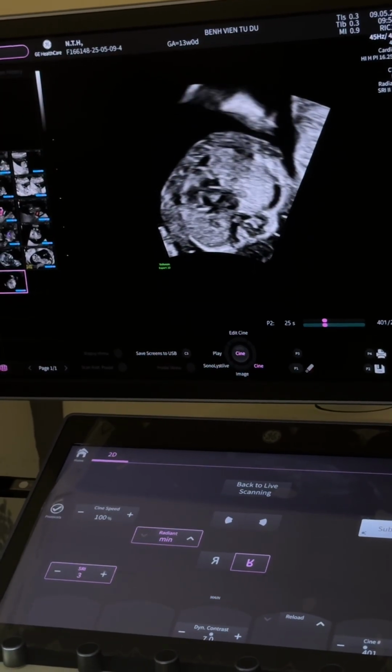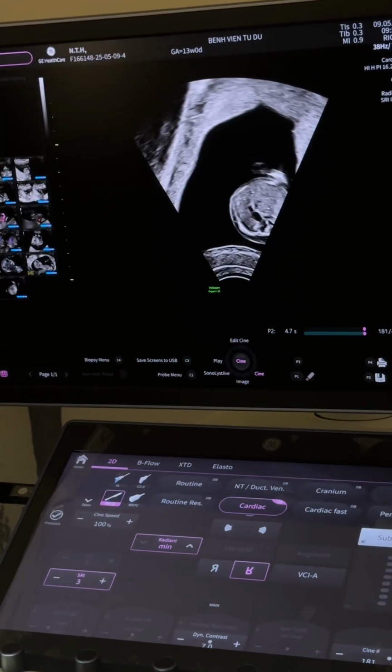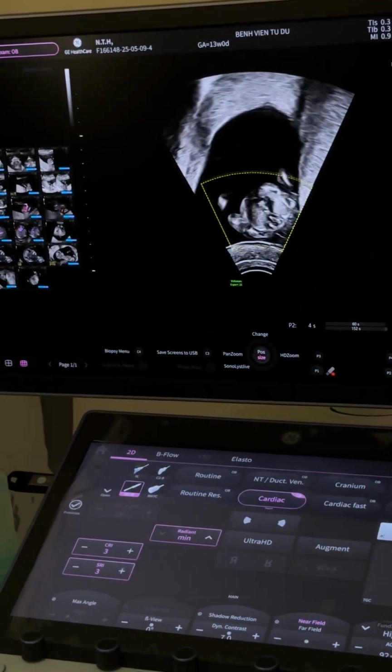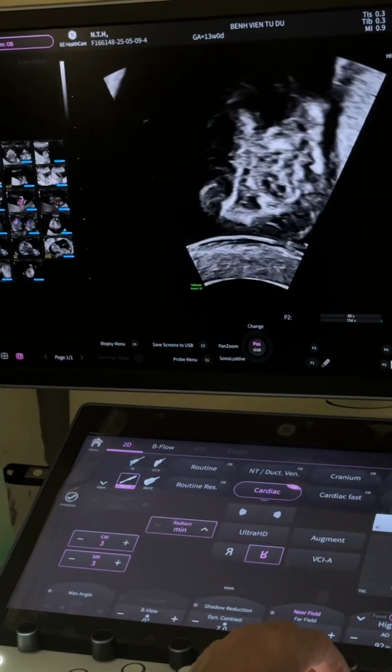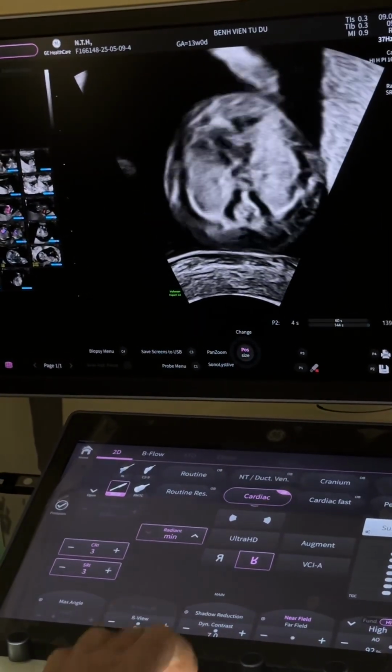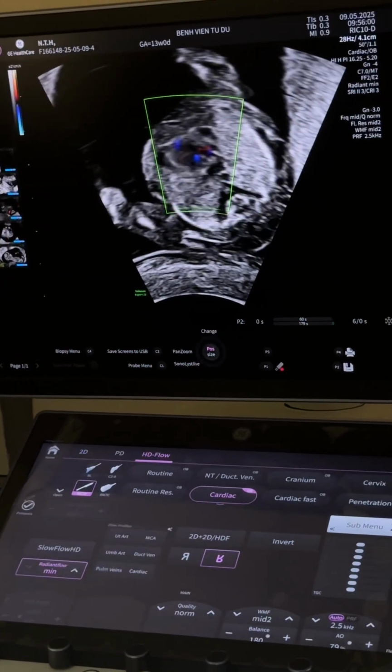And that for me is going to be a significant pericardial effusion. I don't have a figure for cutoff in the first trimester. I look to see, one, is it circumferential? Does it extend up to the right atrioventricular groove or not? That's the important thing.